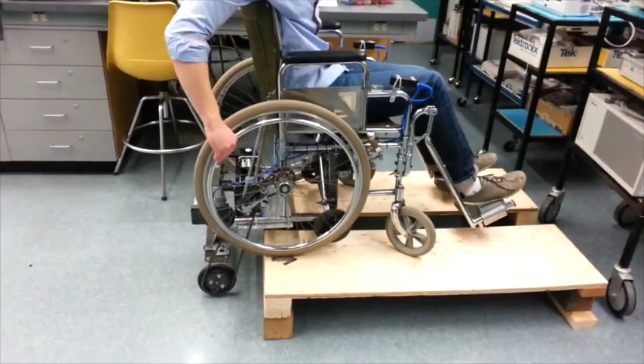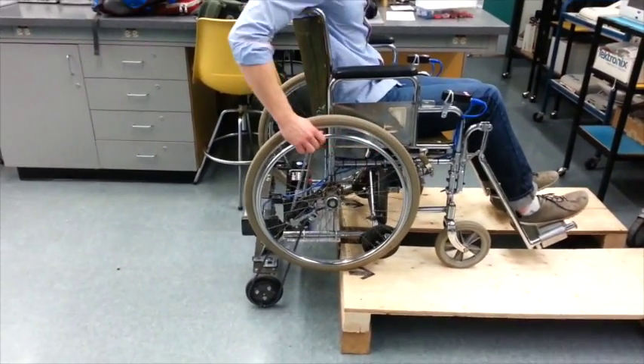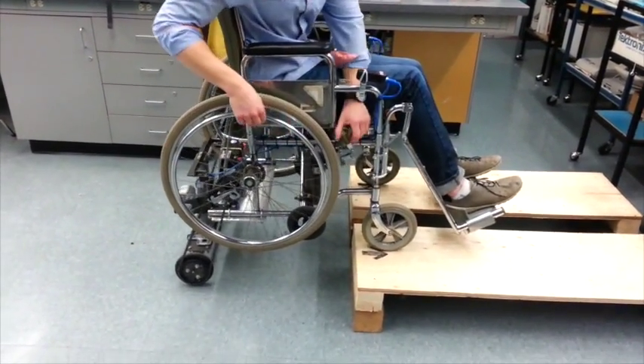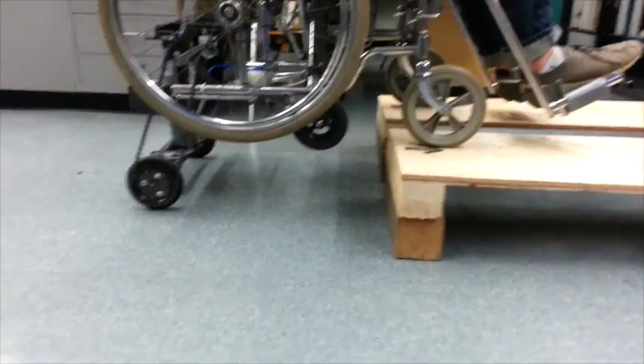Remove the brake and drive the wheelchair back until the front axle is clear of the curb. Re-apply the brake and hold the up switch for the front axle until it is on the ground completely.